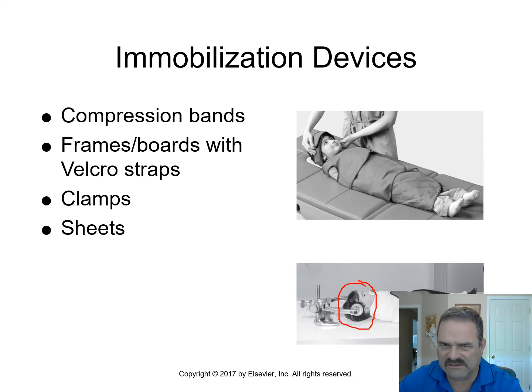Now, if you get a little kid like this that seems to be happy and compliant, why do you even have him strapped down? If he's going to be compliant to be in this papoose, which is what this is, then he's going to be compliant enough to lay on an x-ray table. But, oh my Lord, this looks, oof, man, poor little dude. He's got his binky, looks like he's doing pretty well, but scary kind of stuff. He's all strapped down. Most kids do not allow that. Notice also that we have a shield protection here for gonads. I don't know what x-ray they're doing, but this looks very extreme.